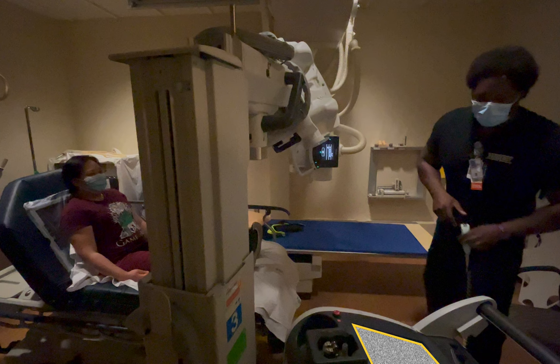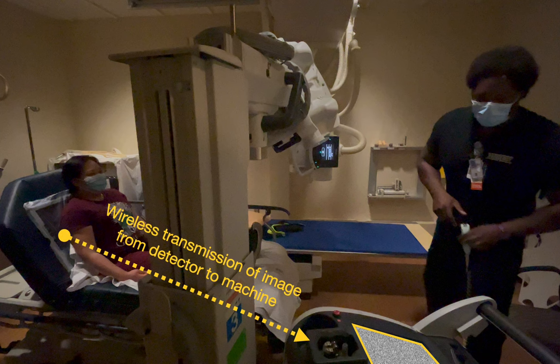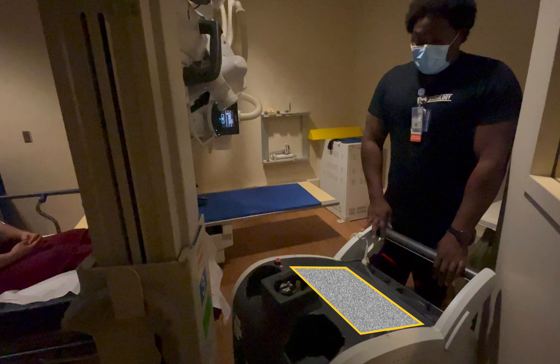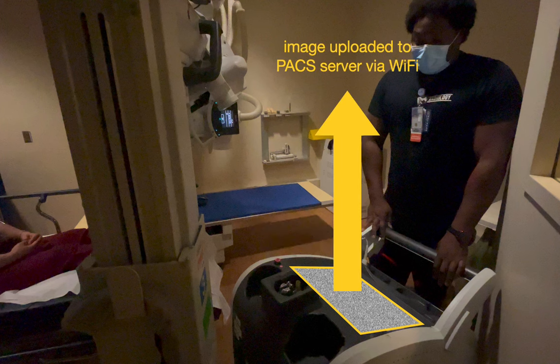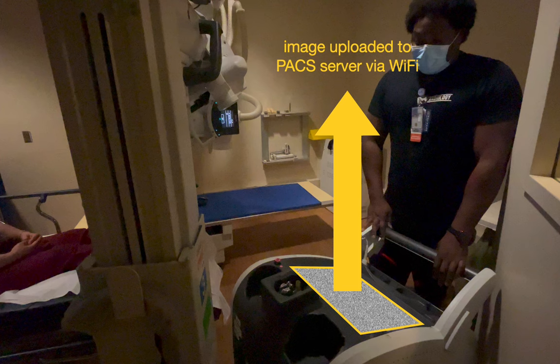The image captured by the DR x-ray detector panel is wirelessly transmitted to the computer within the x-ray unit, and the x-ray tech will check to see if the image they just took is acceptable. If it is, the image is uploaded via Wi-Fi to the hospital-wide PACS system.